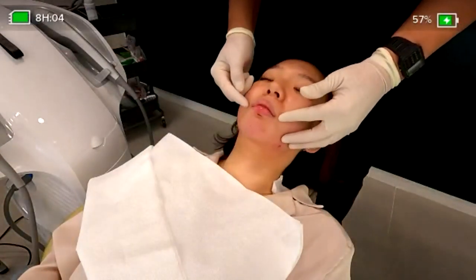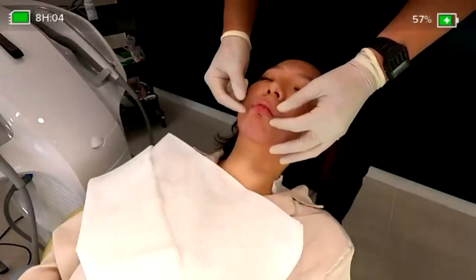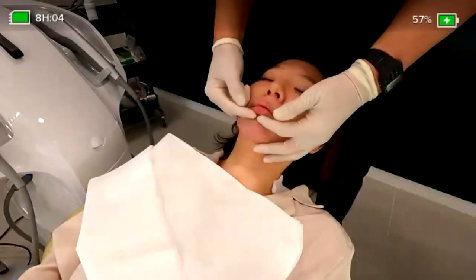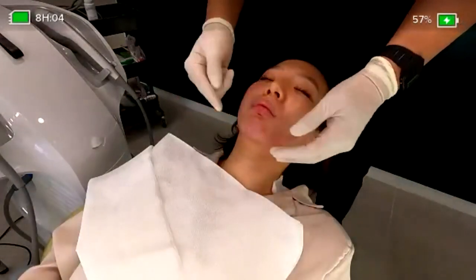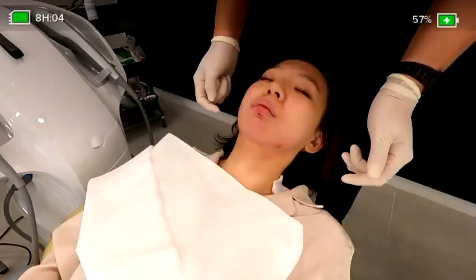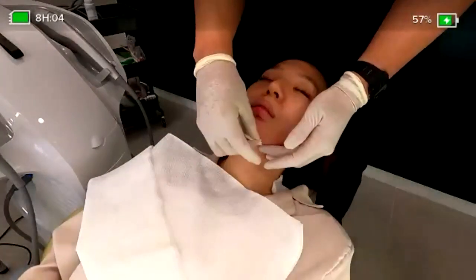And for the angular lips, we changed the smiling angles. Also, we changed these lines in the lip to make a better ratio. And finally, for the contouring with the Photoshop images, we made the chin augmentation.